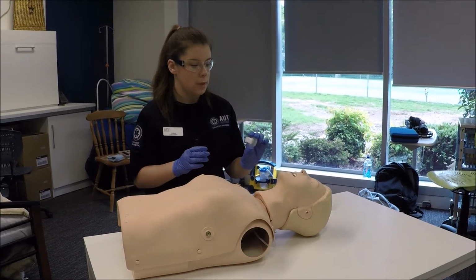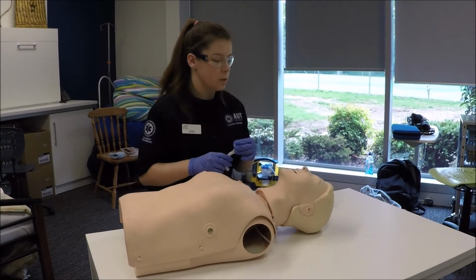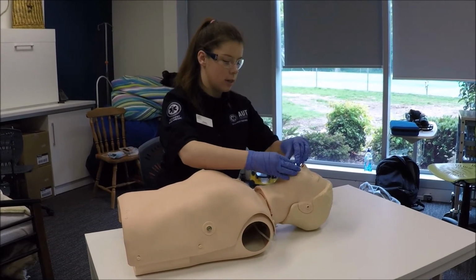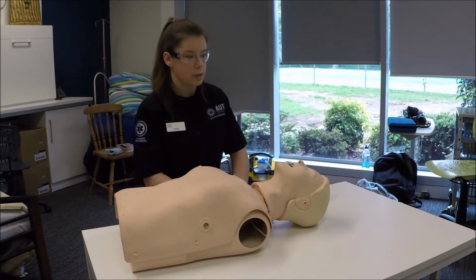So we measure the OPA from the corner of the mouth to the angle of the mandible, as such. To insert it, we insert into the patient's mouth, avoiding the tongue, and then rotate 180 degrees into the mouth, and then just check the patient has taken the OPA well, which this patient has.